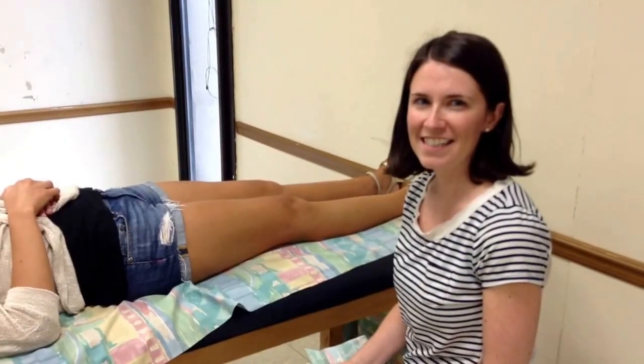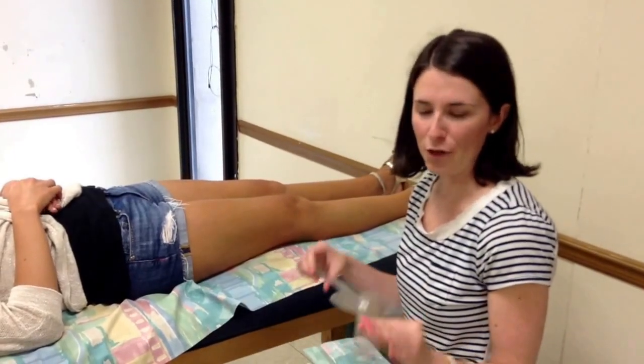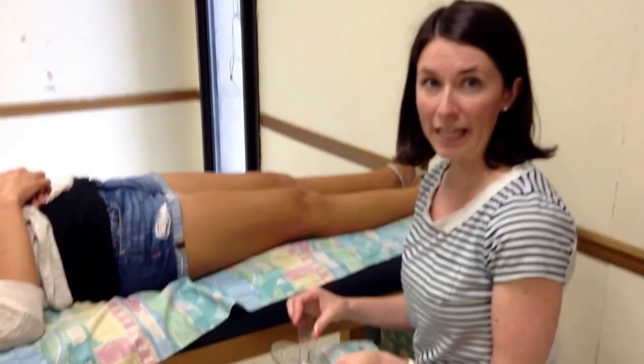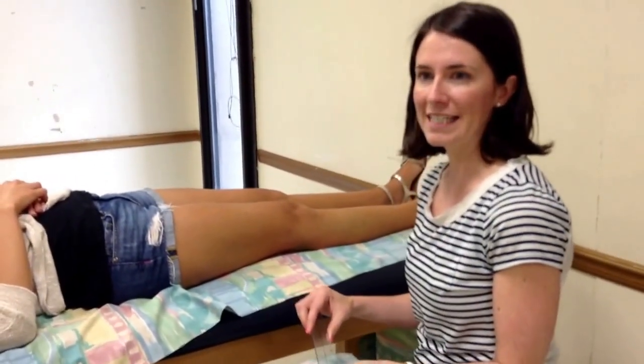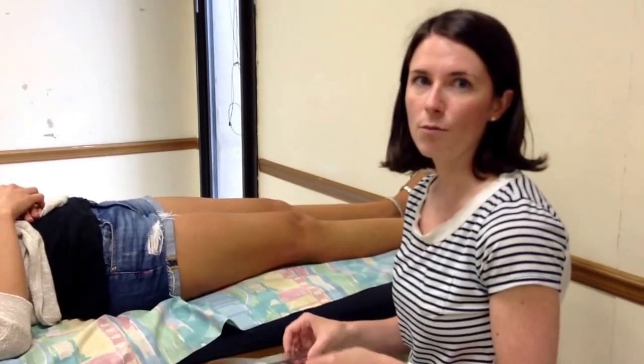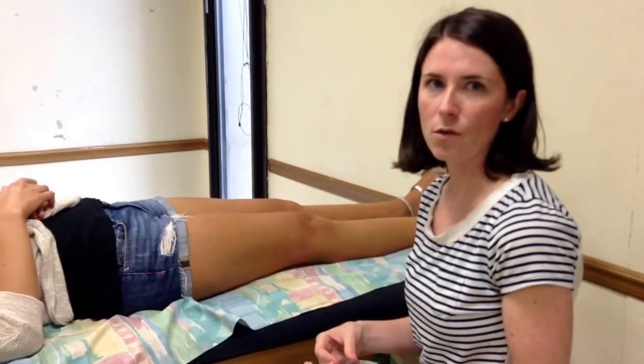This video is about how to measure the knee with your goniometer. Knee flexion and extension occur in the sagittal plane. The end feel for knee extension is firm, and for knee flexion is soft. The normal value is from zero degrees to 150 degrees.